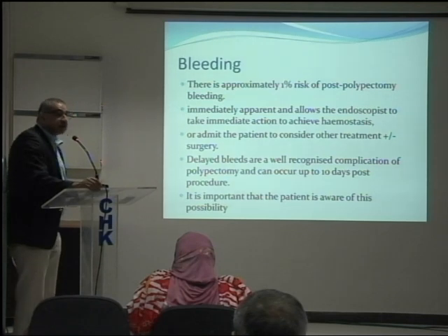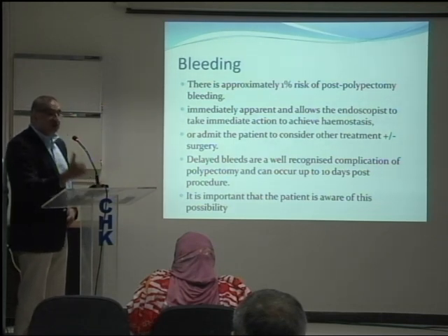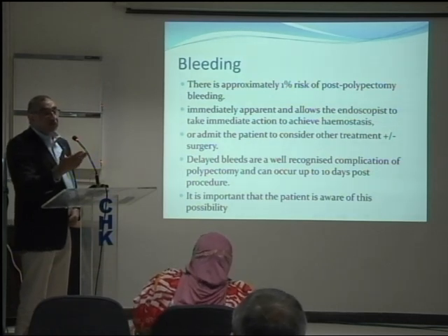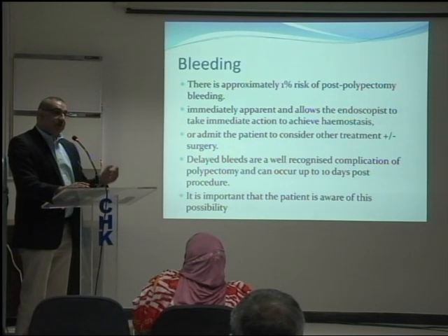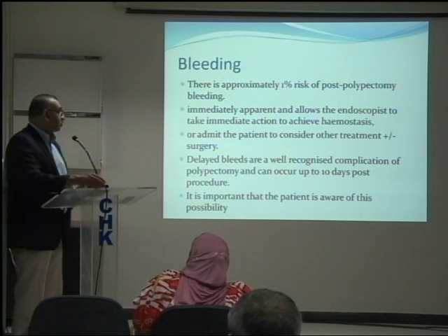And the first thing to do when you are dealing with bleeds is not to panic. When you do your polypectomy, don't take your snare out immediately. Keep it there. Because if the stump is bleeding, you might be in a position to put the snare around the stump and just close it without doing anything else. Just the tamponade, or holding it tight for a few minutes, will buy you time. You can then coagulate it or put something around it.